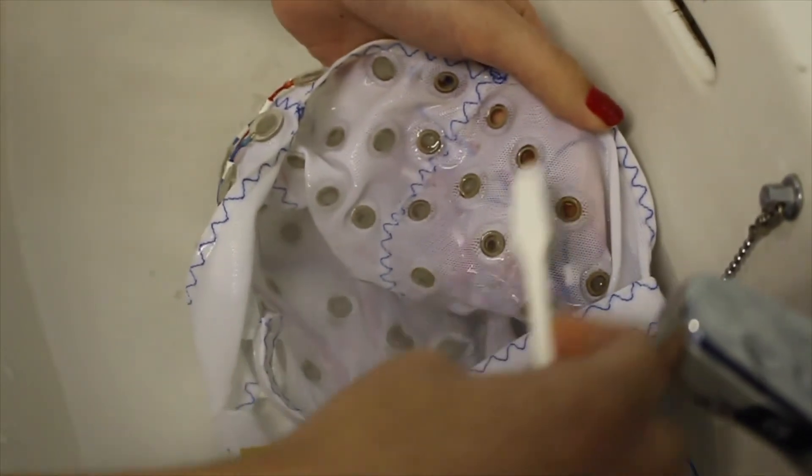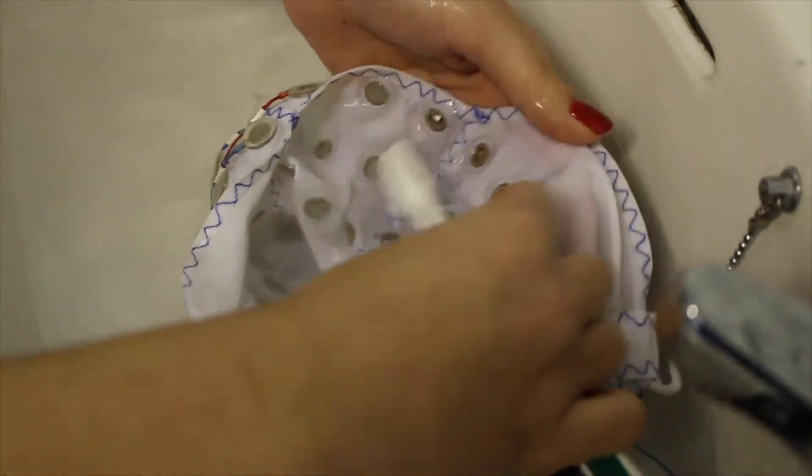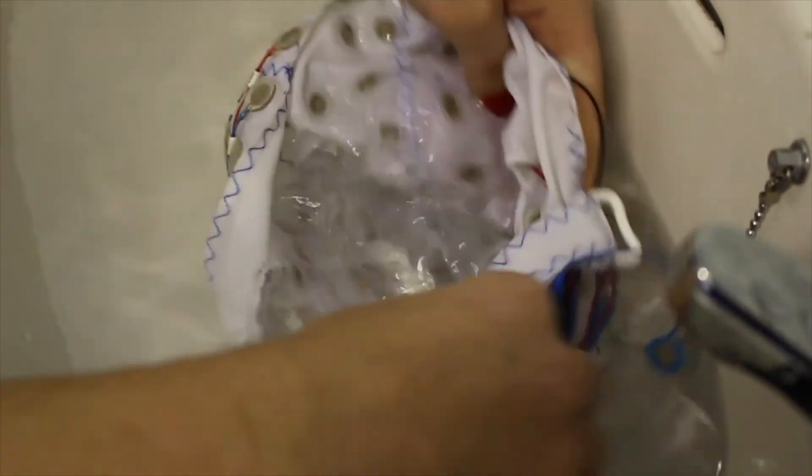Then take a soft toothbrush and gently clean the inside of the cap. Empty the sink and rinse the cap with clean water to get rid of any remaining gel.